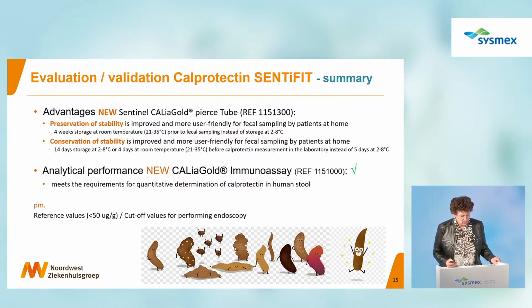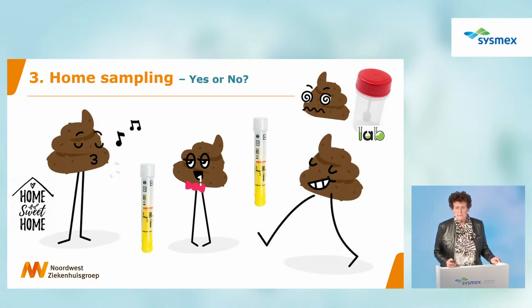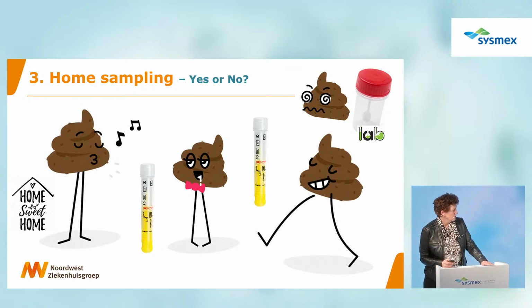At last, I will tell you something about the home sampling procedure, which was introduced during COVID times in our laboratory. Well, there are some questions: are we performing fecal sampling, or must it always be done by a lab technician in the laboratory?